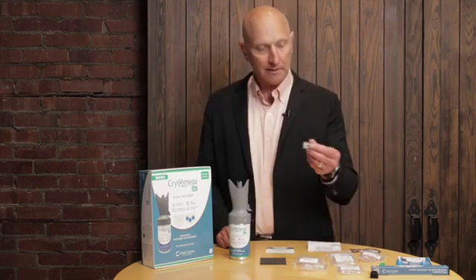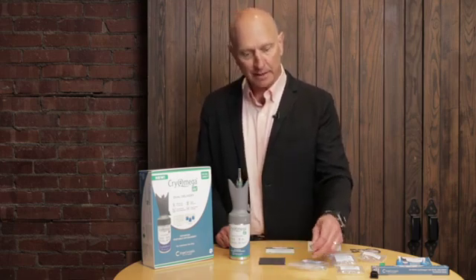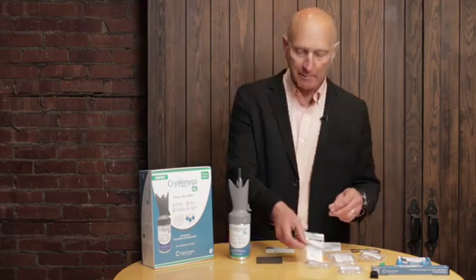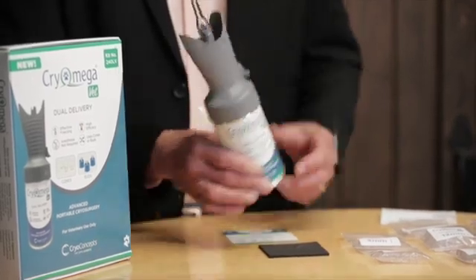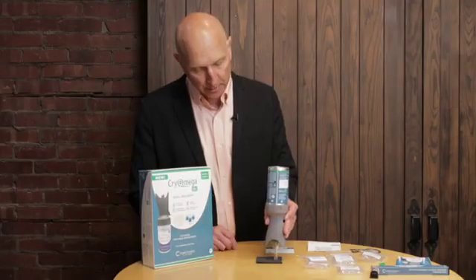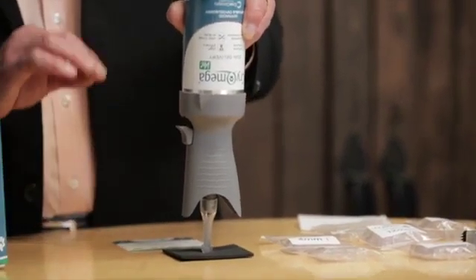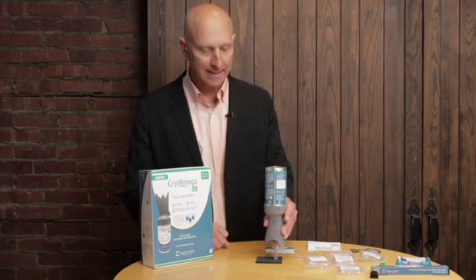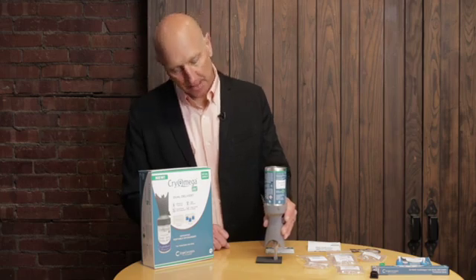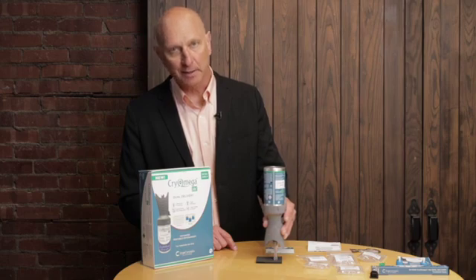In the kit will be a cone adapter that's placed onto the top of the unit, and I'll place the 5 millimeter cone tip, which I've removed from the bag, also onto the top of the cone adapter. This would be placed over the lesion and the trigger pulled for 3 to 5 seconds, which fills the cone with gas. The gas then stays bubbling against the skin, which is drawing heat, freezing it really effectively. The key is to keep the cone in place during the entire time it's bubbling and evaporating. Once it's gone, you can remove the tip.